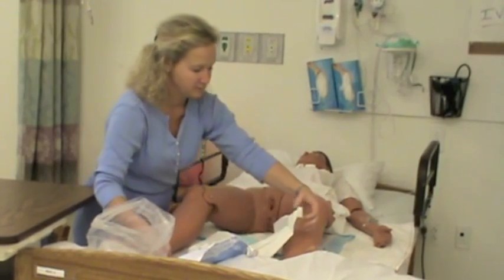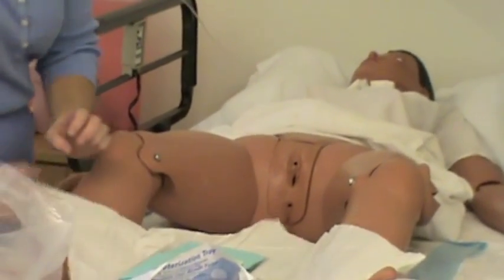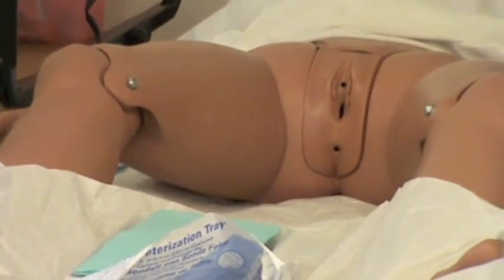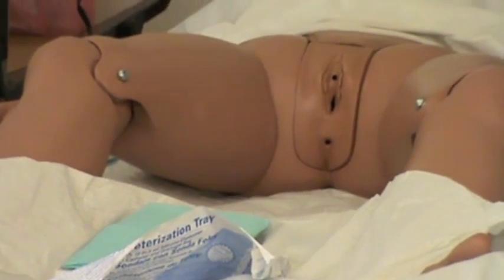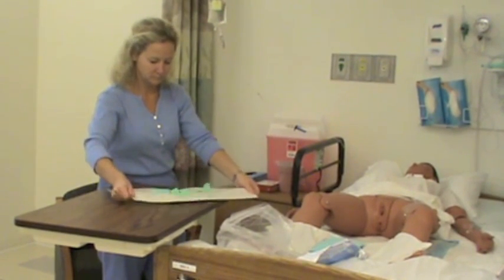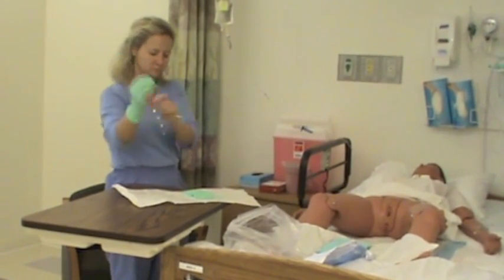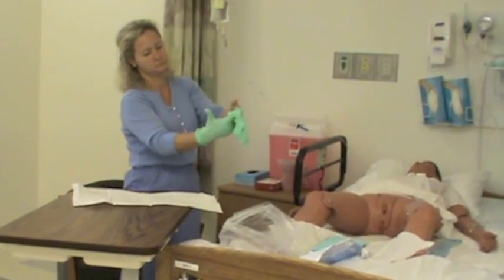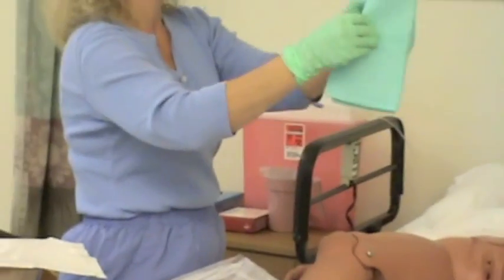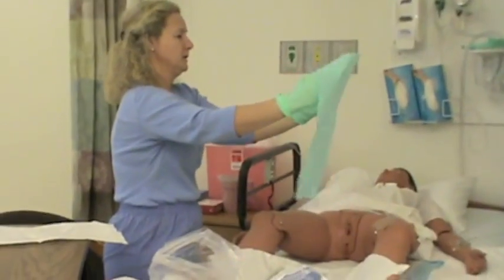Opening the sterile drape: first fold out, second folds to the side, last fold towards me. I'm not going to turn my back on my sterile field while I put on my sterile gloves. I'm not going to use the fenestrated drape — sterile drape, shiny side down. Wrap your hands and the drape.